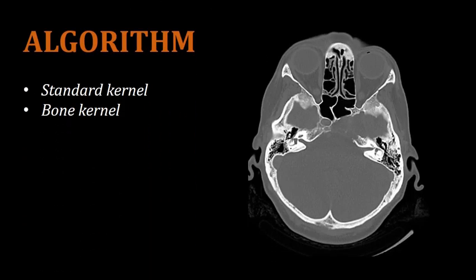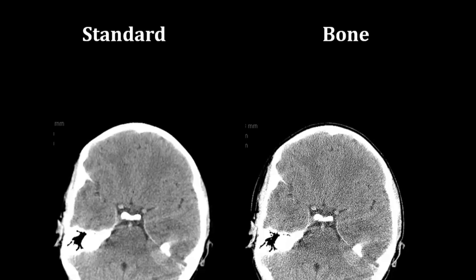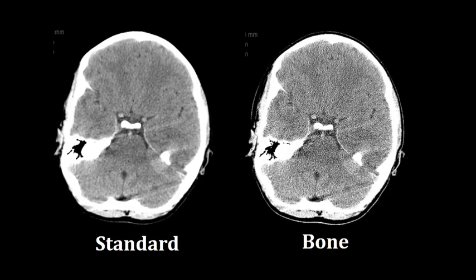A CT head should be performed with both the standard algorithm and the bone algorithm. In these two images of the bony areas at the base of the cranium — same slice, same thickness — the image at the left was completed with the standard algorithm and the image at the right with the bone algorithm. The standard algorithm does not represent bony structures very well, as it is a smoothing filter. The bone algorithm gives us very crisp, high spatial resolution images of the bone. It is still valuable to perform a standard algorithm reconstruction.